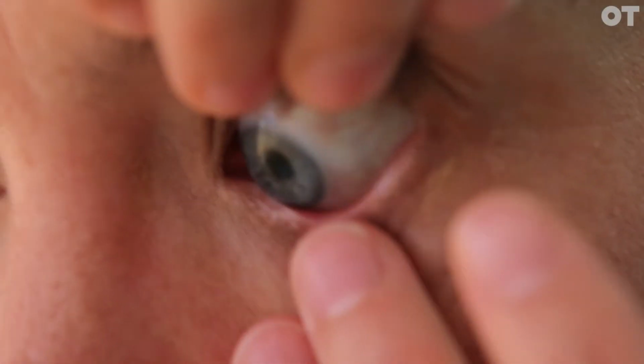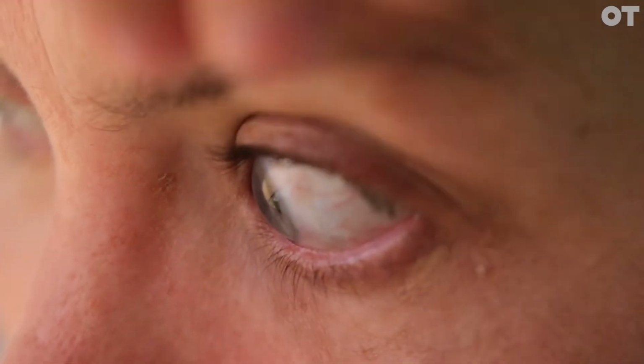It's a bit like, I usually use the analogy, the wet glass on a coaster. You've got a water tension holding that lens against the eye. So unless you break that tension, the lens is just going to slide about. So you need a little bit of pressure, just with the pinch.